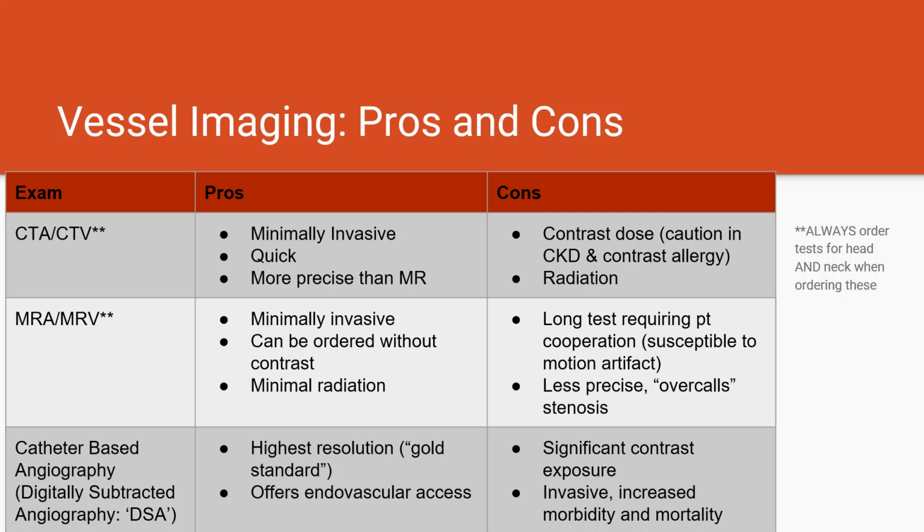Like all CT imaging, the biggest con is the immense amount of contrast associated with it. It's dangerous in patients with kidney injury or contrast allergy. And then don't forget that CTs are associated with a fair amount of radiation. Important to remember, especially in pregnant women.